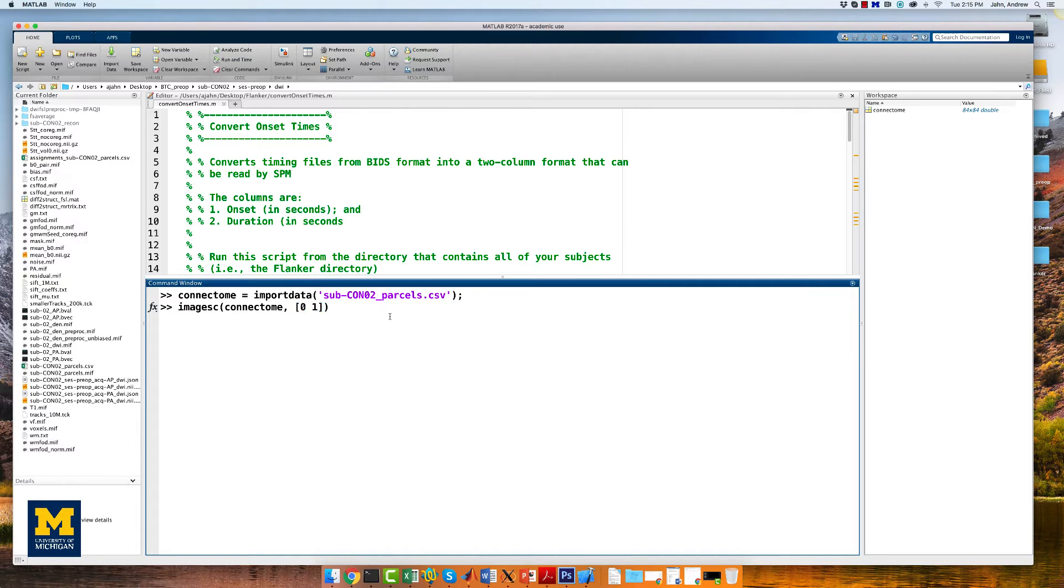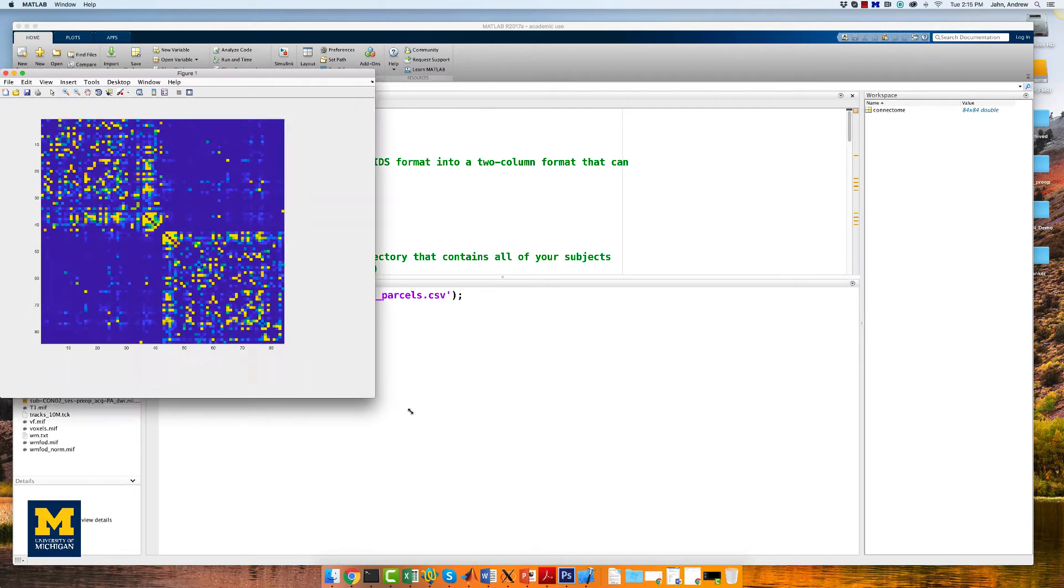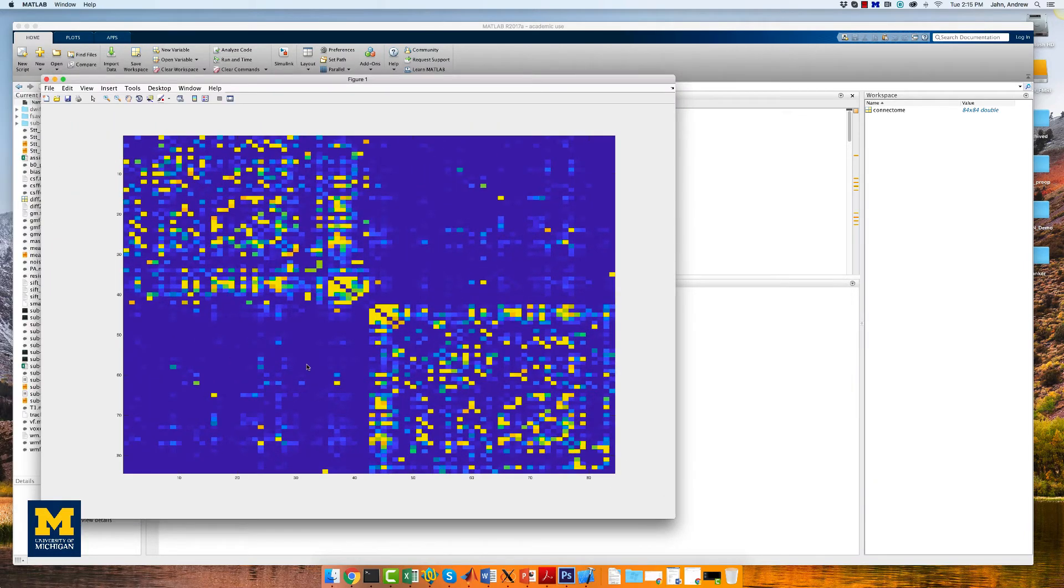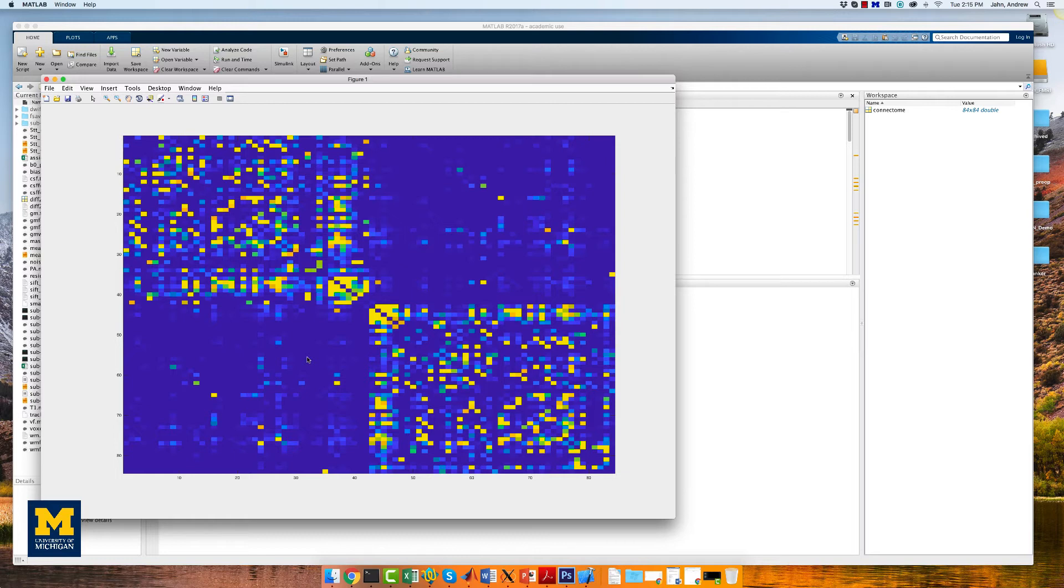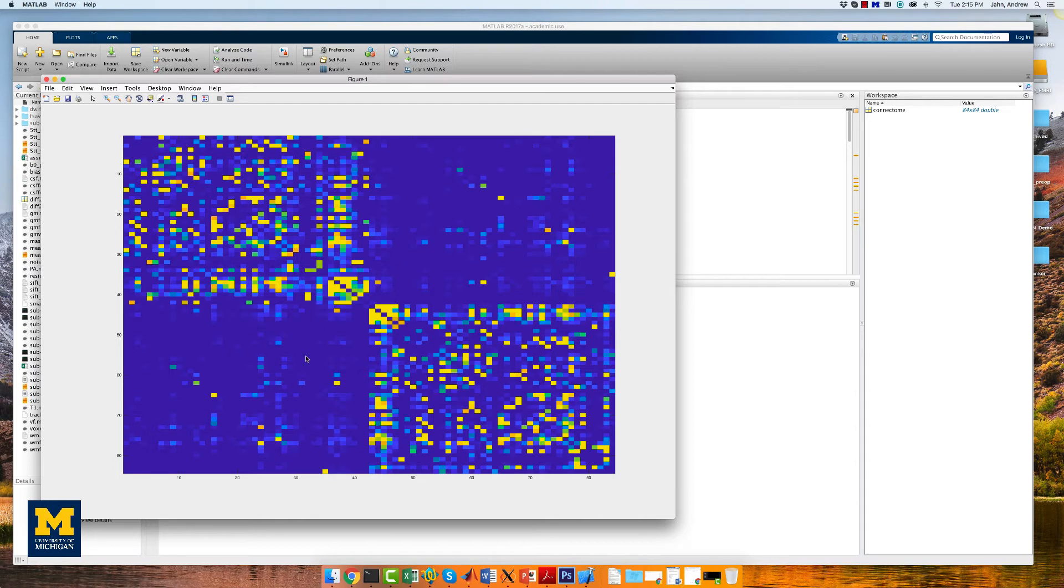Keep in mind that the resulting correlation matrix is symmetrical. The upper triangle is identical to the lower triangle. The most noticeable feature is a division of the figure into two distinct boxes representing increased structural connectivity within each hemisphere. You will also observe some clusters of brighter voxels representing higher structural connectivity between nearby nodes.